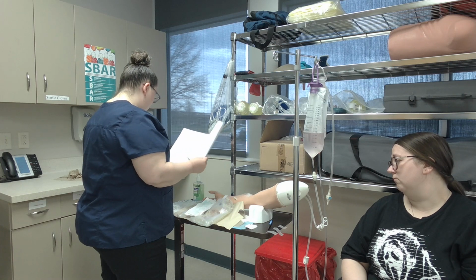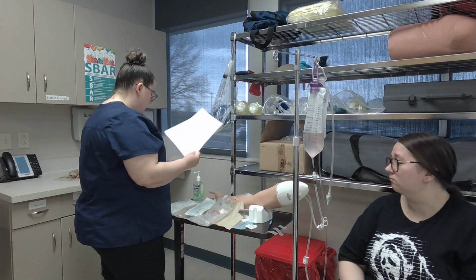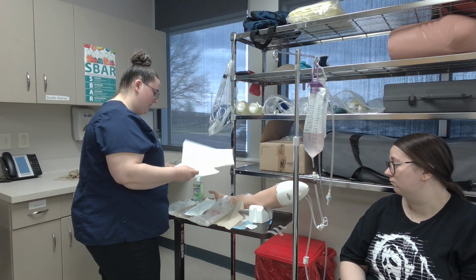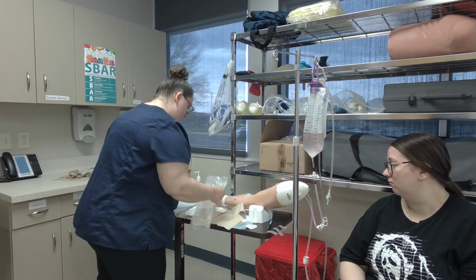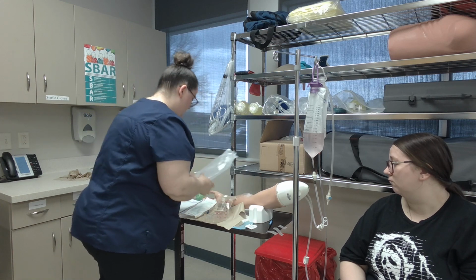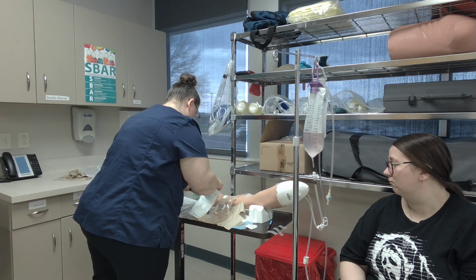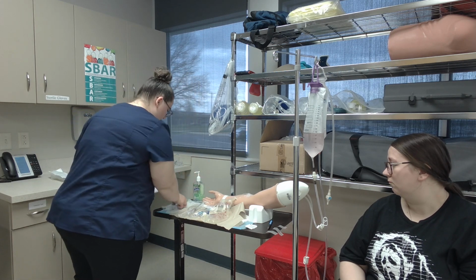And I will be giving 100 ml per hour, 25 drops per minute. And that is 12 to 13 drops per 30 seconds. I will get this medication out and ready here. And get everything else set up. And I'm going to put my gloves on.